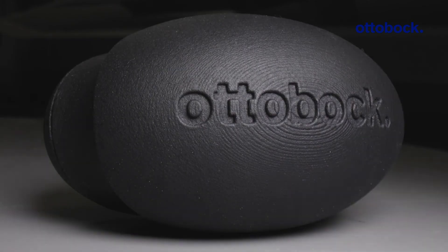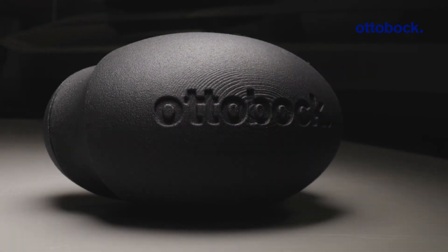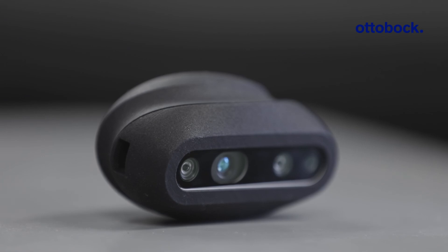I'm very confident that prosthetists and CPOs will figure out how to use this scanner. I'm really excited about the continued future development in MyFit TT as we continue moving along.